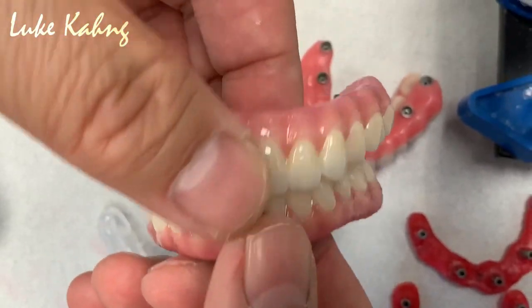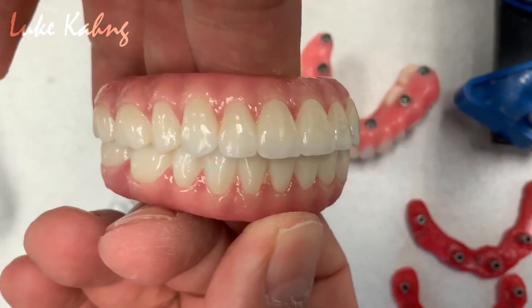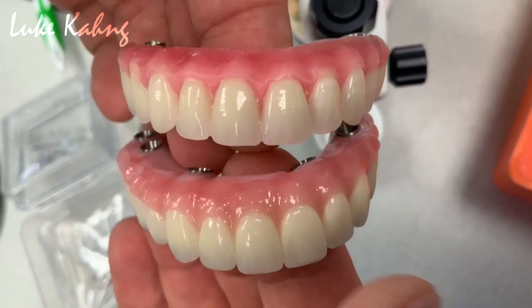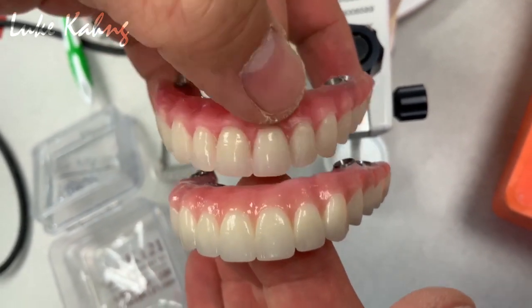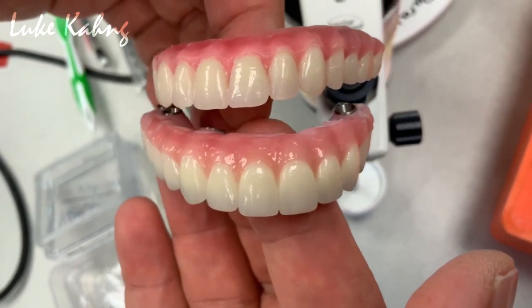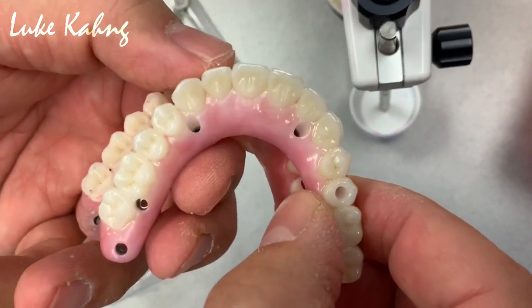This one is 5 implants and 6 implants. Alright, let's finish another Saiten 4500 6 implants with wax setup and improve it. The aesthetics, basically 2M1 base, slightly layered. And here's the old model.